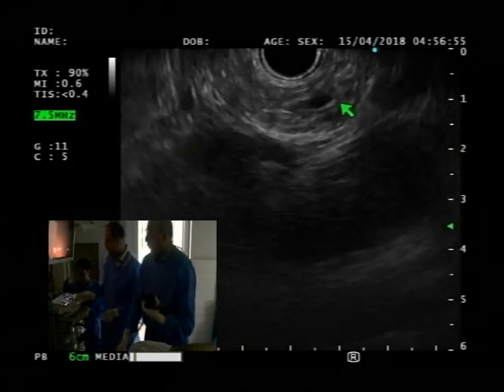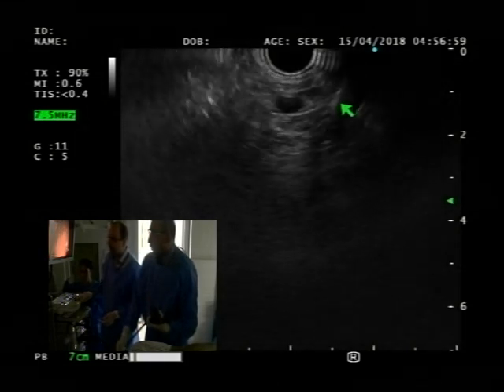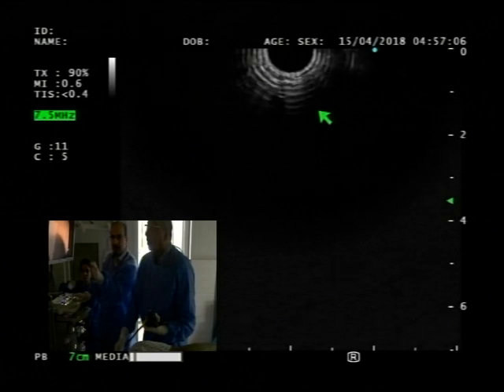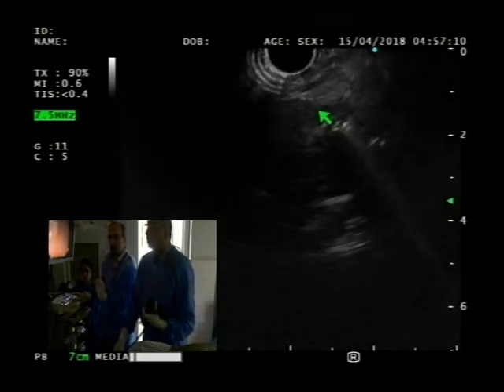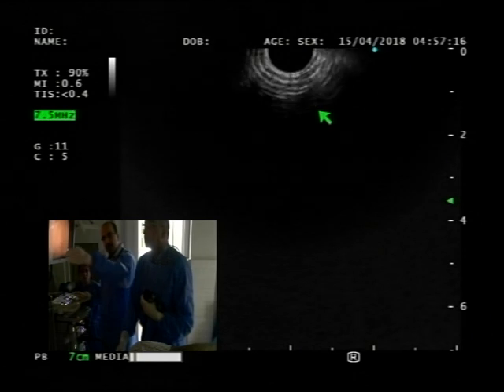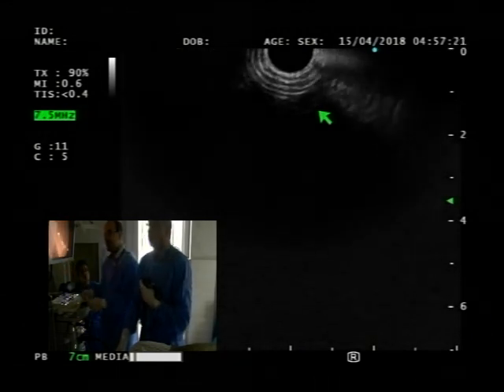There you go. Keep going counter. Excellent. Keep going. And now it's dipping down. When it's dipping down, that means from this part, the proximal stomach, this is as far as you can see. If you want to see more of the duct, you may have to advance a bit, suction the stomach out, turn into that posterior wall again, and see if by pulling back, you can see the pancreatic duct.